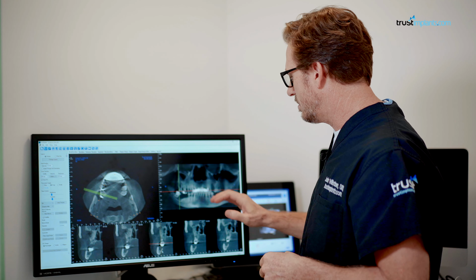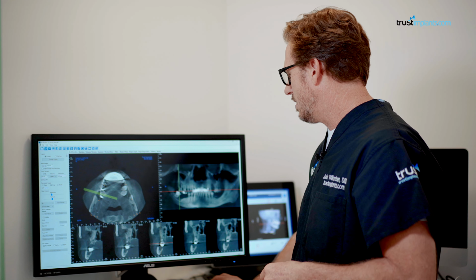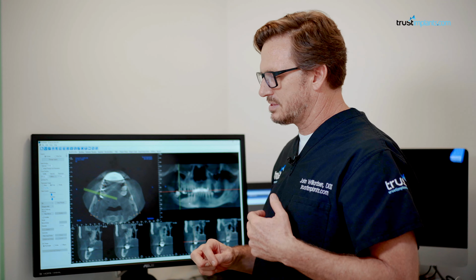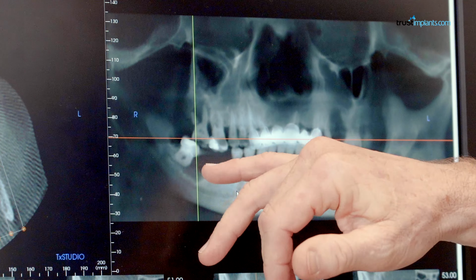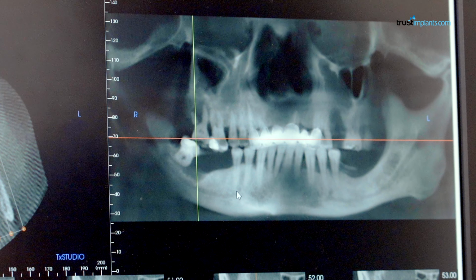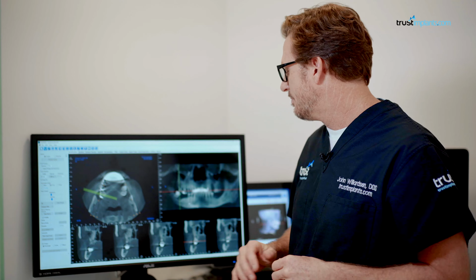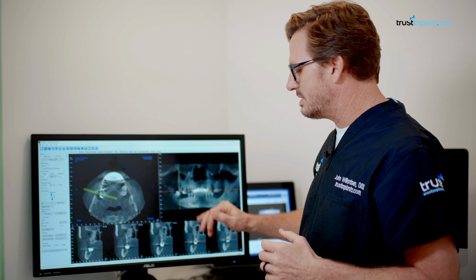And so we'll take the remaining teeth out, and once I pull these teeth out, a lot of these corporate implant centers, we'll call them, will do what's called an alveoloplasty. They will level off that bone and cut away a good 4, 5, sometimes 7, 8 millimeters of bone, which is a lot. We don't do that here, because what that does is it creates a scenario so that the prosthesis, or the teeth that replace the teeth we're extracting, does not represent at all what they had before.